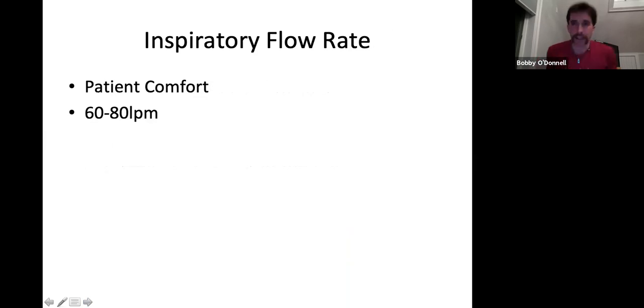Inspiratory flow rate is reflective of the patient's comfort. So that's how fast a breath is being delivered. We actually don't have a flow rate button on the LTV1200. There's a calculation that it does in the background of the algorithms of the machine, and it'll pop up as VCalc. You'll see when you're looking at your ventilator and it's just toggling through, as on your normal transport, you'll see PIP, F, which is your respiratory rate, tidal volume, and it's just these things that pop through, and then you'll see VCalc. That's your flow rate, and that's based basically off your minute ventilation and your I time.